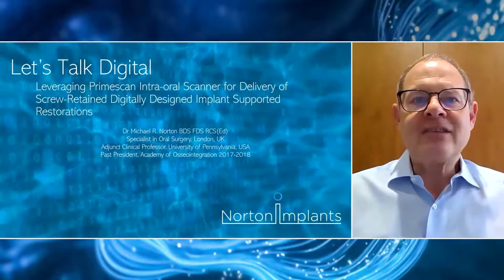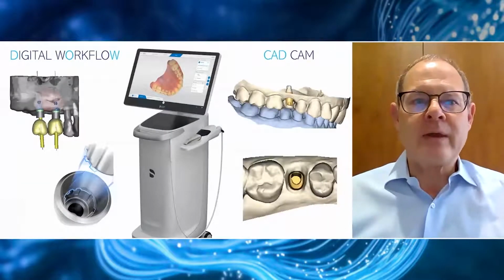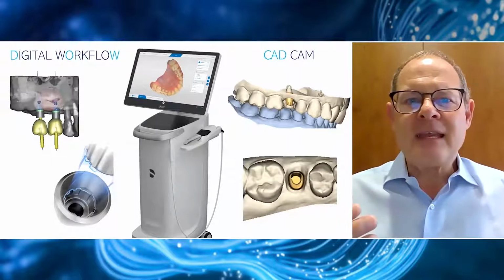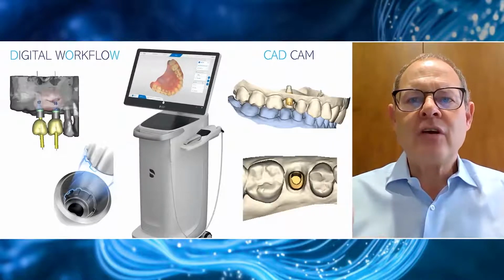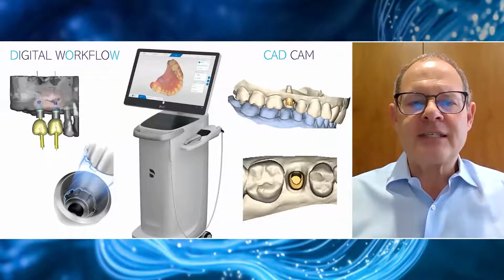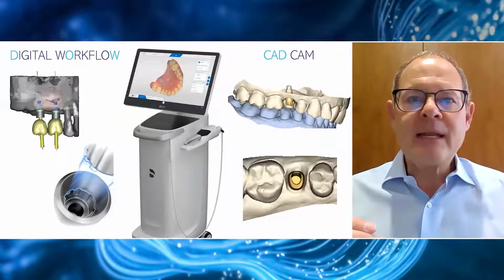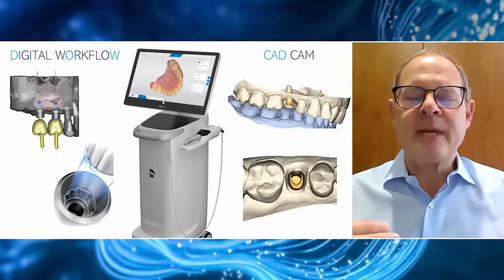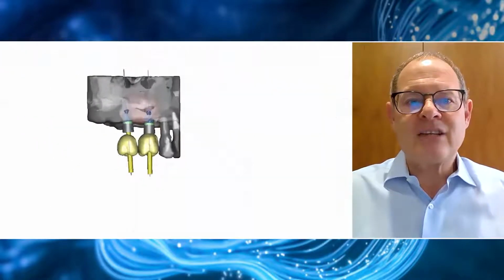Essentially, what I'd like to do is go through a workflow with you that includes not just the digital planning side of things and the digital scanning side of things, but also the incorporation of digital technologies, both at the implant and abutment level, to deliver what I believe to be the finest implant-supported restorations that I've been able to deliver in my 30 years of implant dentistry.